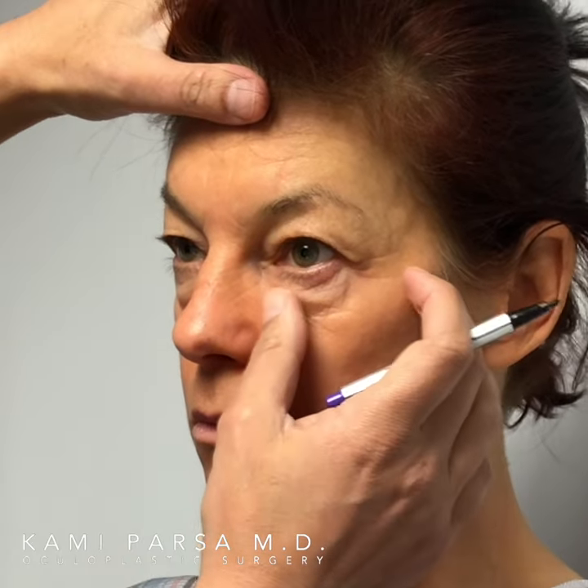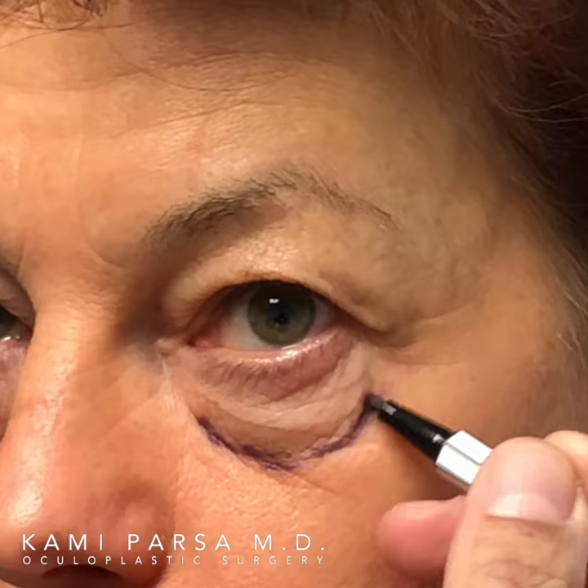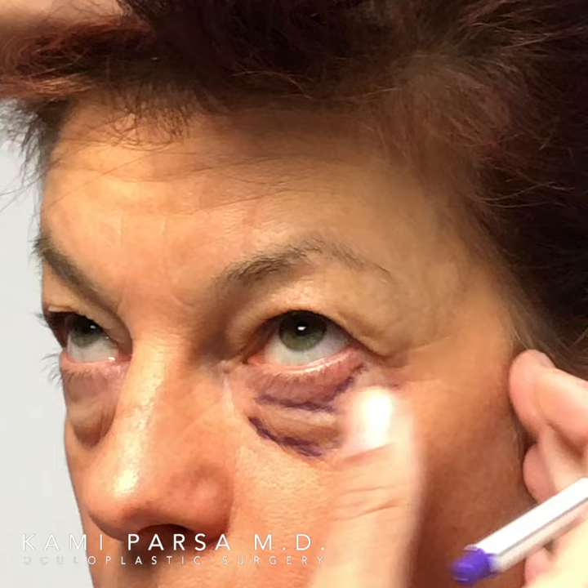On this beautiful patient, I'm doing upper and lower eyelid blepharoplasty. As you can see, she has some volume loss. I start with marking the boundaries — this is the orbital rim, so look all the way up for me. As you can tell, the lower eyelids are loose, so we do have to tighten it in the corner.